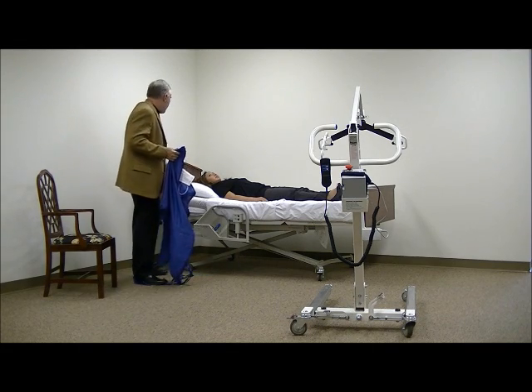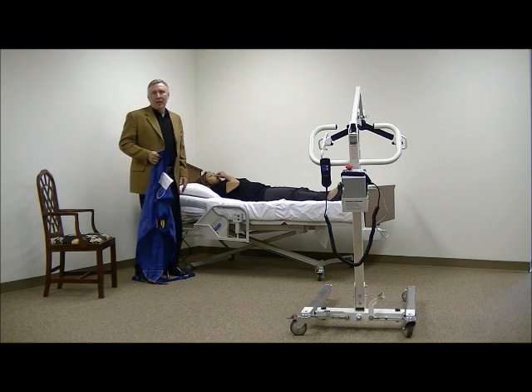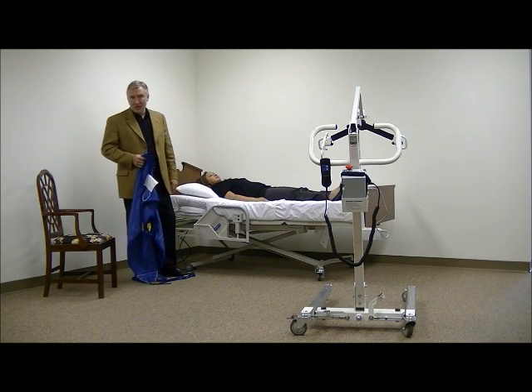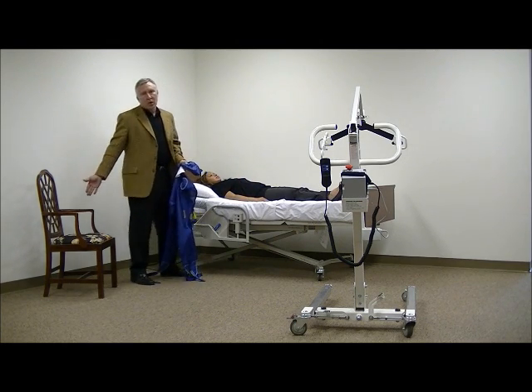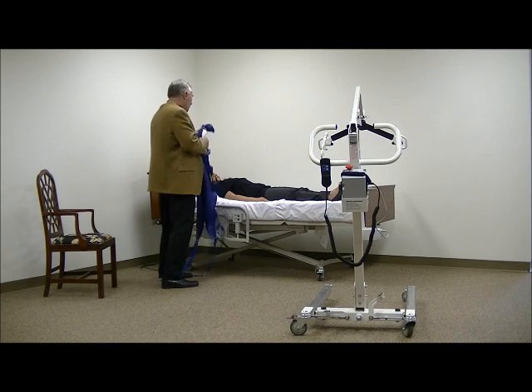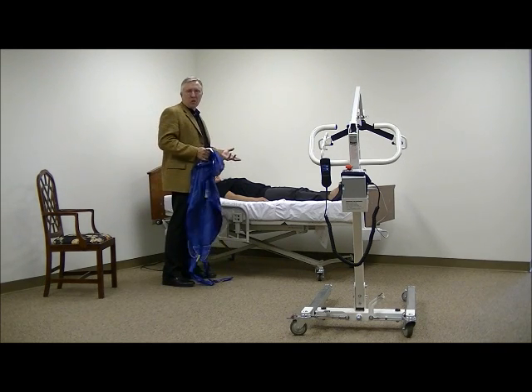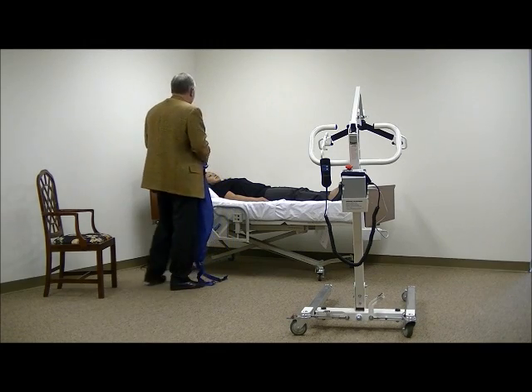Now there is a technique you can use to raise the bed head up so a patient is more in a semi-sitting position. And then you can apply the sling the same way you applied it when the person was in the chair, if the patient can tolerate that type of position in the bed. But a lot of times when you're using slings like this, the patient simply can't sit up as well or doesn't have as much control over their body, so they need to be completely transferred.